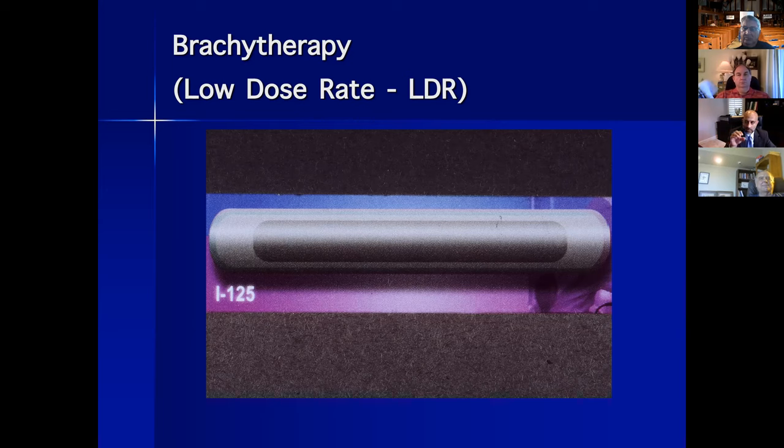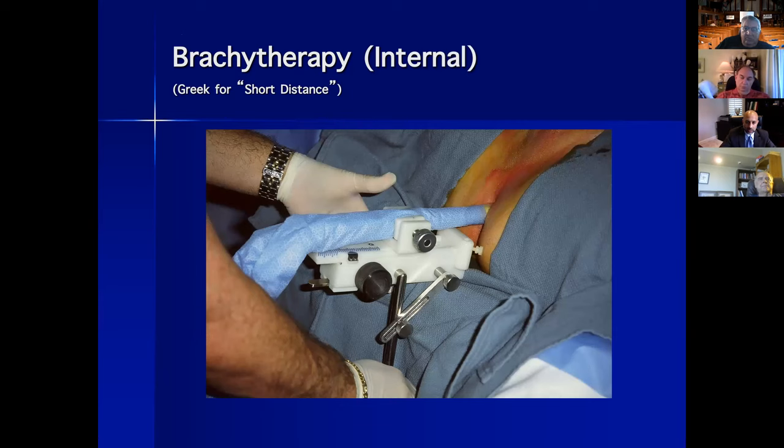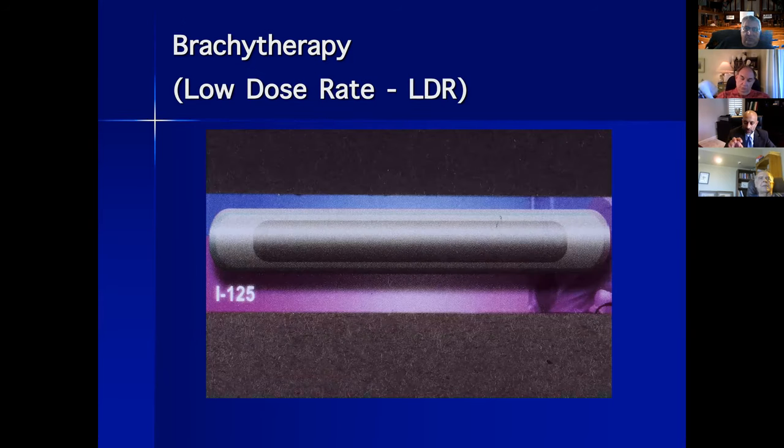And by doing that, you could be very accurate in terms of controlling for motion of the gland and image guidance. Because you're depositing radiation directly internally, you would get less rectal dose and confine the radiation dose a little more accurately to the prostate gland. The way they did that was by putting a series of needles directly into the prostate gland via ultrasound guidance, which is what that prior picture showed, and depositing little radioactive pellets or seeds directly into the prostate gland itself. Most commonly, we've used iodine-125 or palladium to do this.